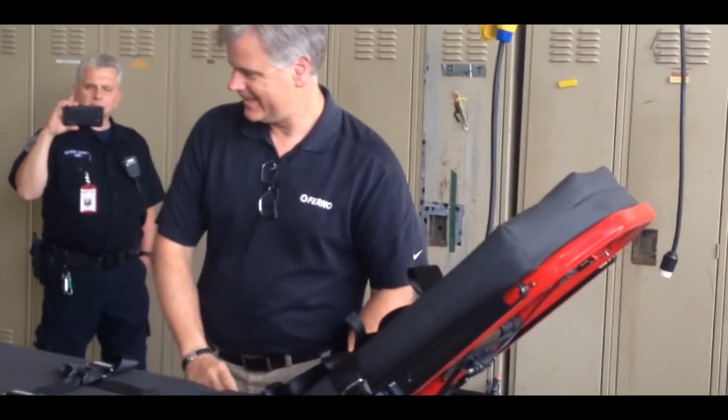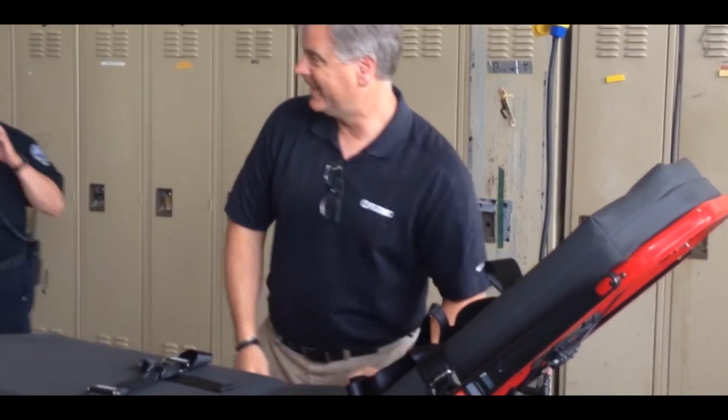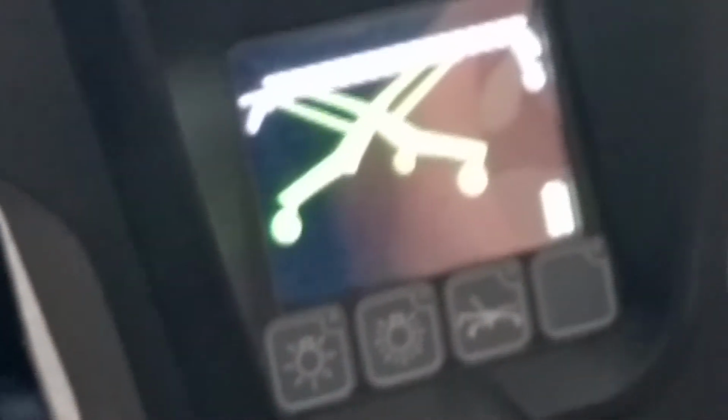What's this coming down to? Self-destruct. Yeah, it looks like it. 3, 2, 1. So that's called chair mode, and it came about by Joe Borgraff, who actually owns the company.